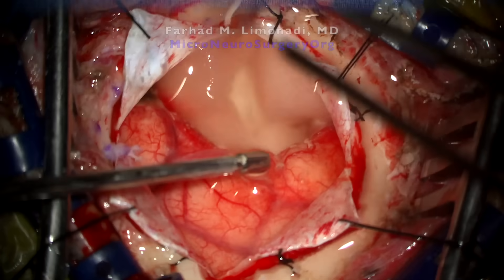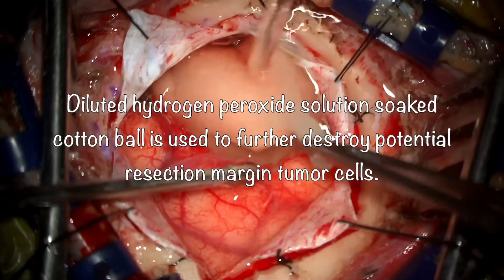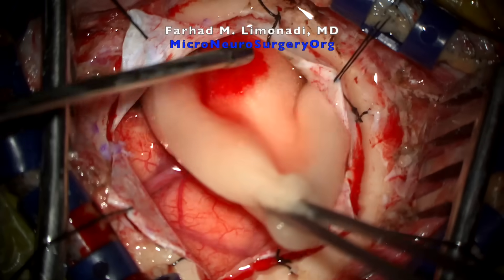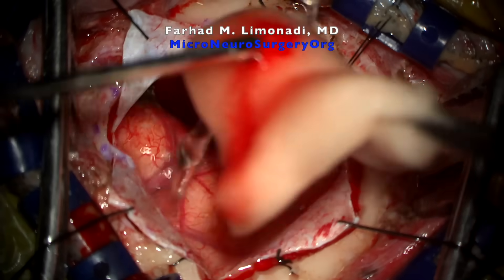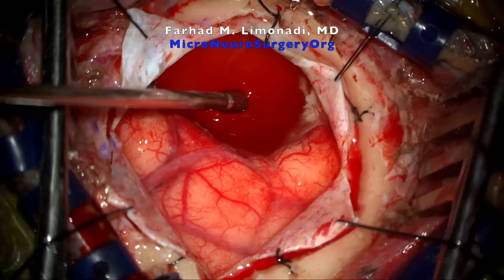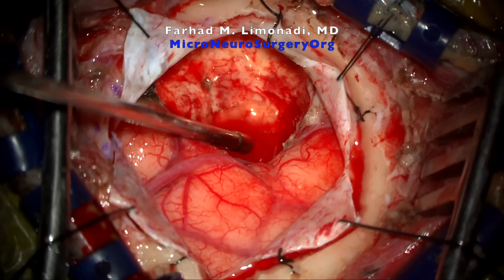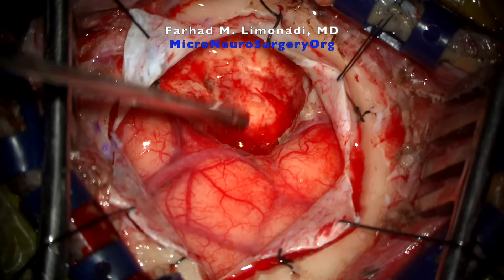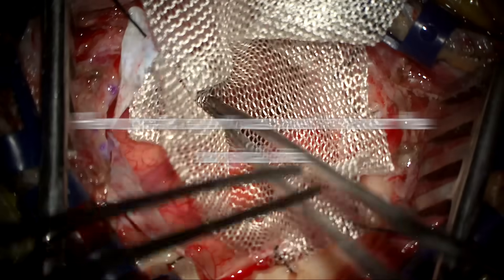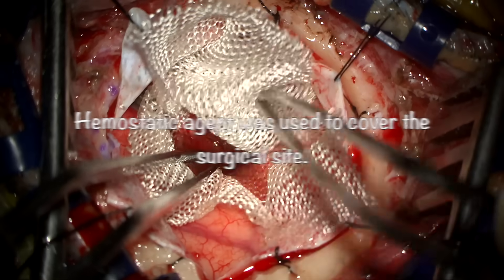Hydrogen peroxide solution-soaked cotton balls are laid over the cavity of the tumor resection site, both for destruction of neoplastic cells that may reside in the cavity and for hemostasis. The cavity is also covered with a hemostatic agent.